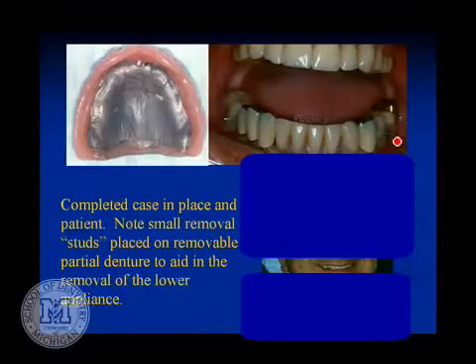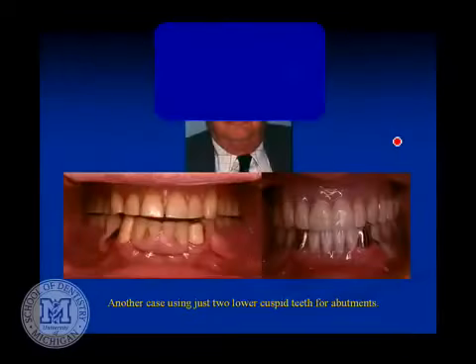They can't put them in or get them out. And so the idea is also, when selecting an attachment, if you're even thinking of going that way, what's the patient's manual dexterity? Can they adequately get these things in and out? That's a legitimate question to be asking oneself.